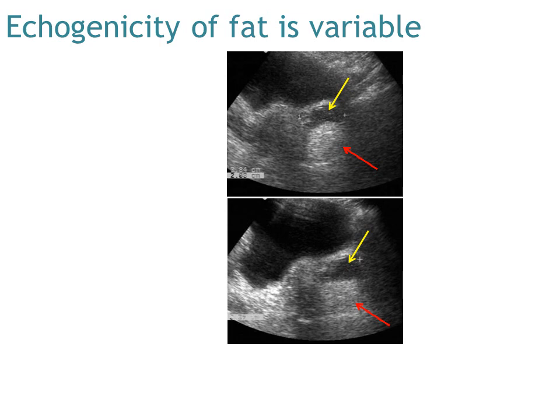As you have seen, echogenicity of fat, which is a hallmark of mature cystic teratoma, is variable. This ovarian mass has two areas, a hyperechoic dependent portion and a hypoechoic non-dependent portion. Because of this echogenic area, we may suggest mature cystic teratoma, and probably many of you expect this echogenic area will be the fatty portion of the teratoma.